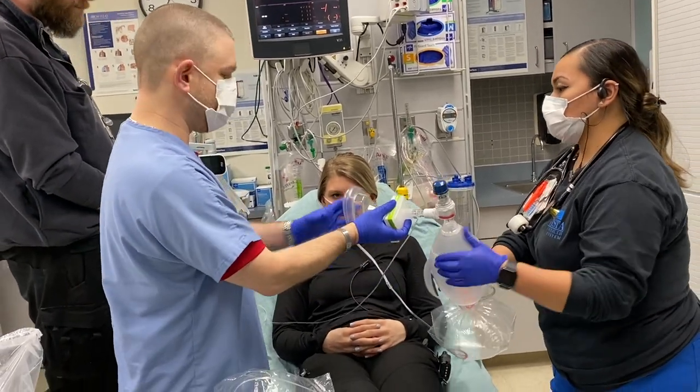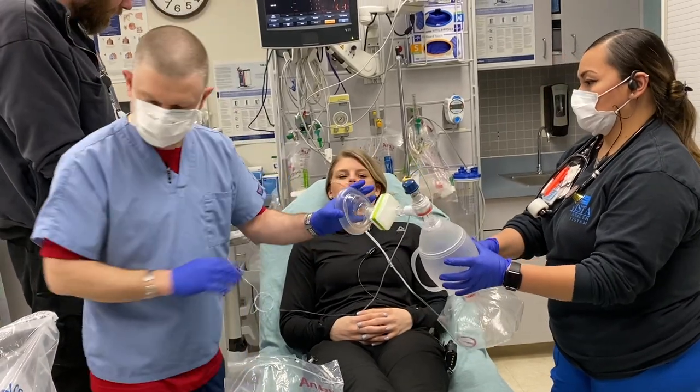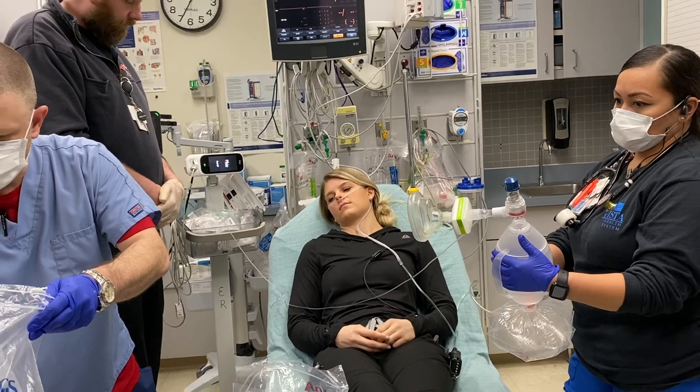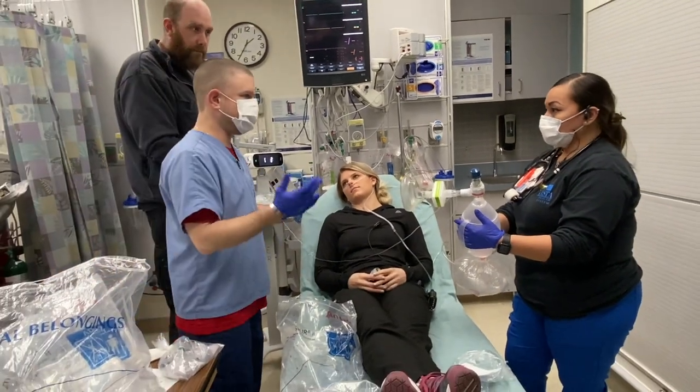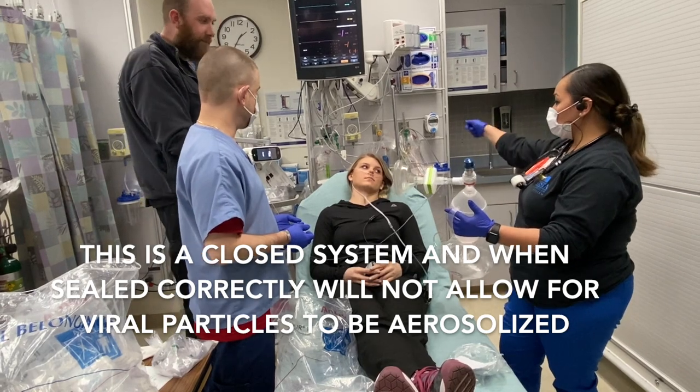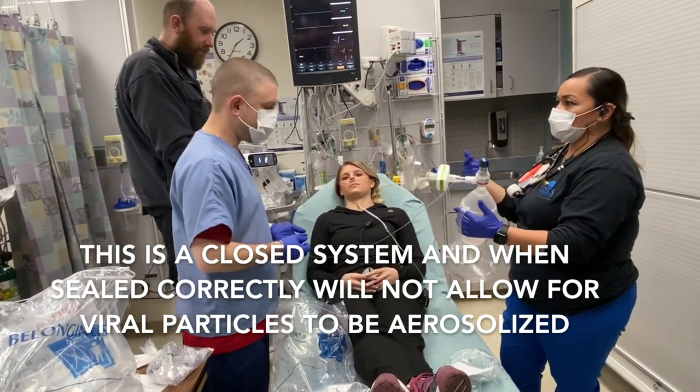So the next thing that we're gonna do, we have everything hooked up. I don't think that we're missing anything. Can you guys think of anything? We have to double check ourselves. No, I think we're good. We'll just have to turn up the nasal cannula to 4 to 6 liters per minute.